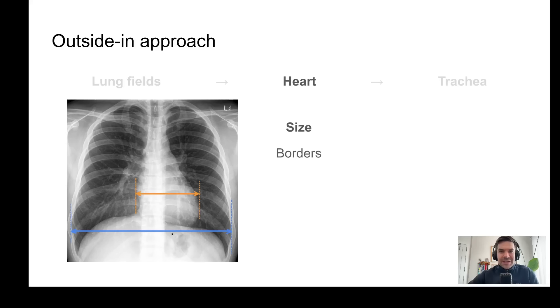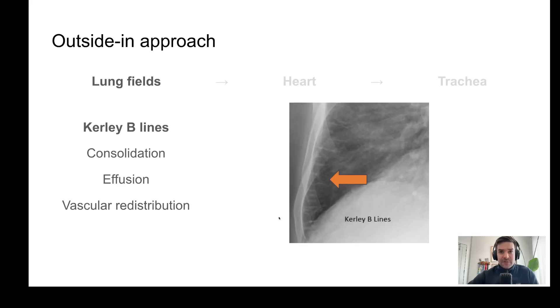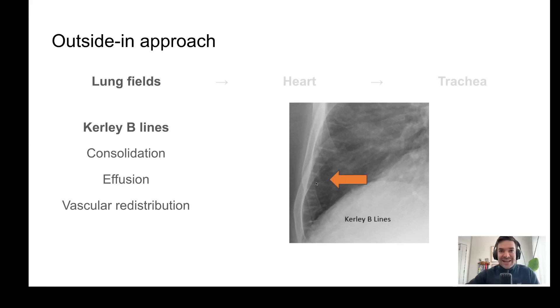Working outwards to the lung fields, here's some pathology: vascular redistribution can be indicative of pulmonary edema, often from congestive heart failure. Kerley B lines — when I was a medical student I thought they were 'curly,' but no, it's a person's last name. The lines themselves are straight and are again suggestive of pulmonary edema.